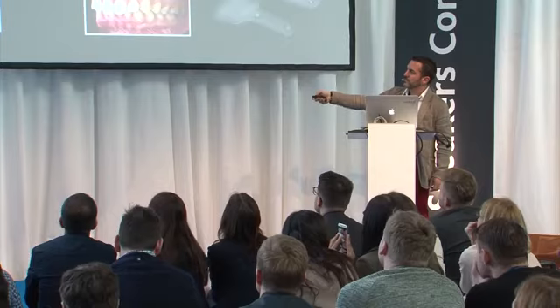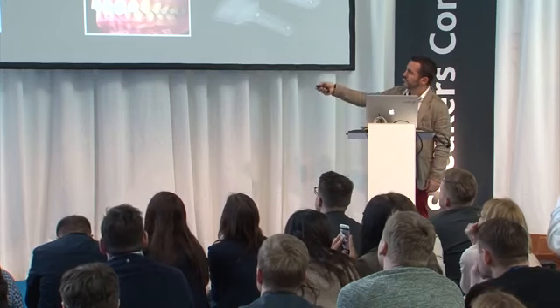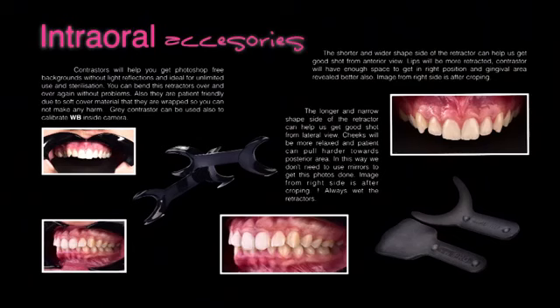And here, the lateral position, I use these special retractors. And from this photo, without using the mirror, I'm getting this photo here. So it is much less time consuming. I just take the camera, take these settings, I shoot, and that's it. You crop it in the Keynote after that.